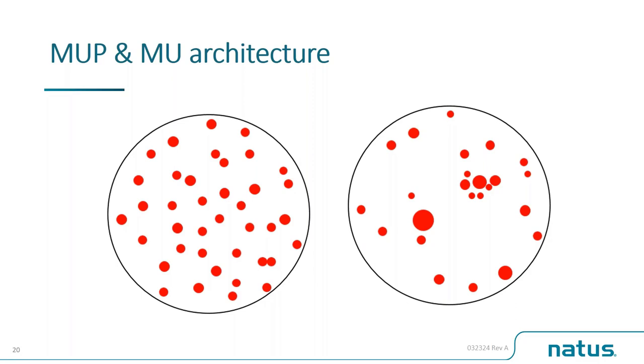In neurogenic, you tend to be more similar, large amplitude, long duration polyphasic. In myopathy, it is much more tricky. And once again, quantitative analysis can be useful there. Anyway, so how do we do motor unit potential analysis?